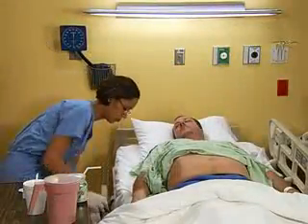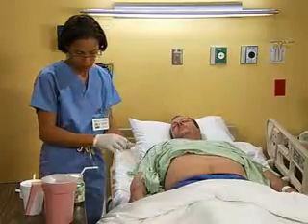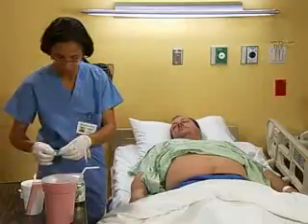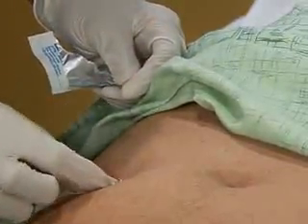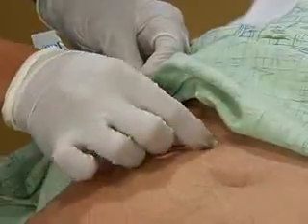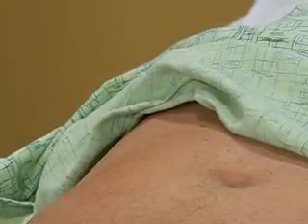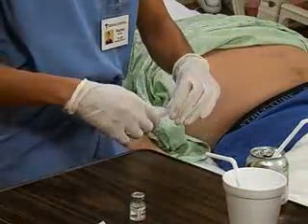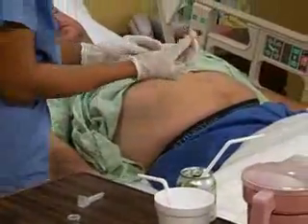After performing hand hygiene and putting on gloves, relocate the site using anatomical landmarks. Then clean it with an alcohol swab, beginning at the center and spiraling out for about 2 inches. Let the site dry. Hold a new swab between the 3rd and 4th fingers of your non-dominant hand. Remove the needle cap or sheath by pulling it straight off.